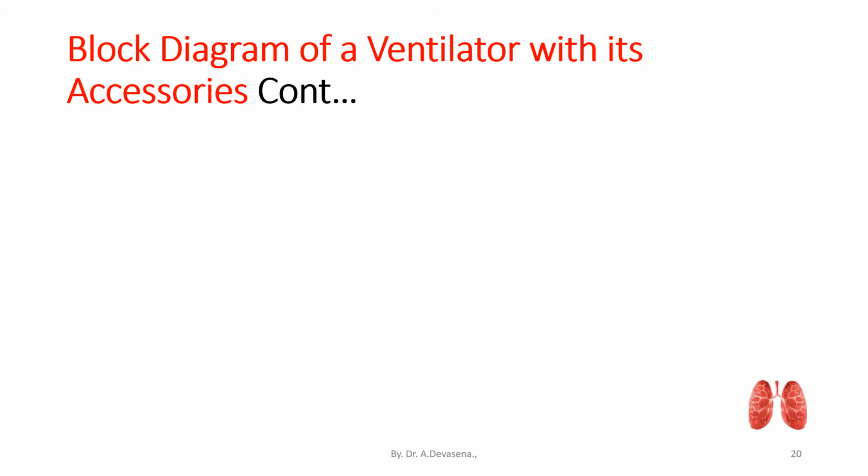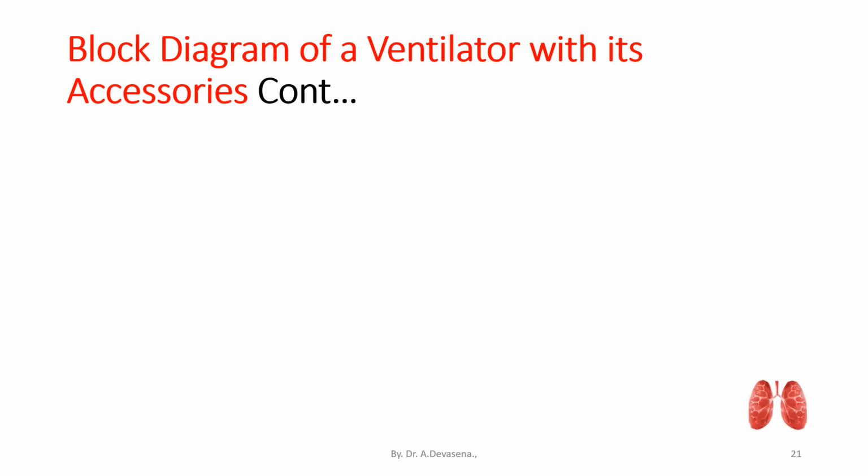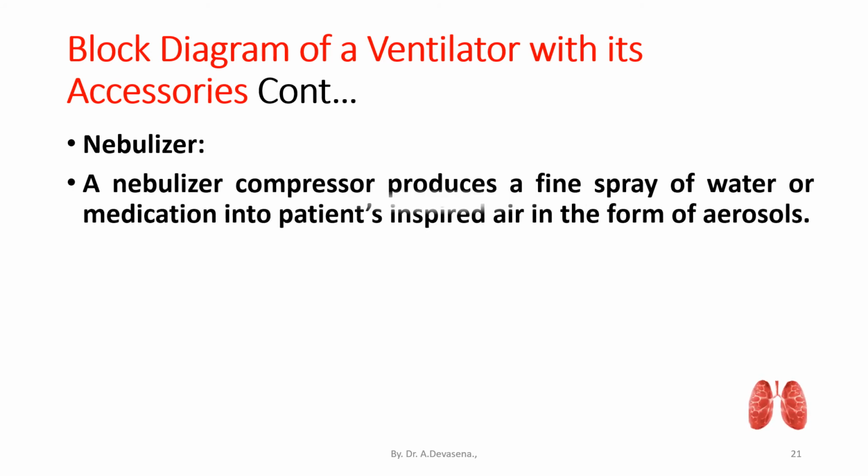Humidifier. In order to prevent damage to the patient's lungs, the applied air or oxygen must be humidified either by heat vaporization, that is steam, or by bubbling an air stream through a jar of water. Nebulizer. A nebulizer compressor produces a fine spray of water or medication into patients' inspired air in the form of aerosols.